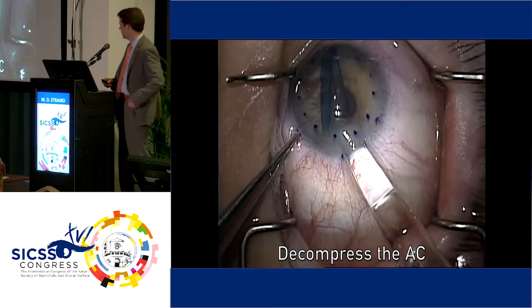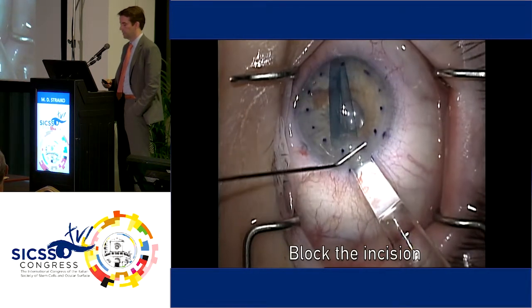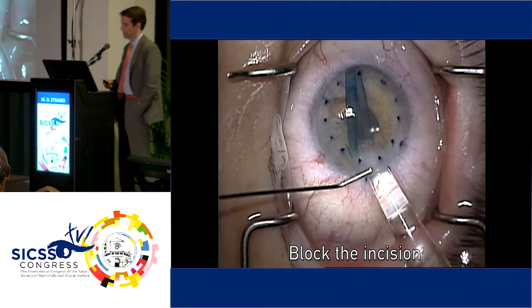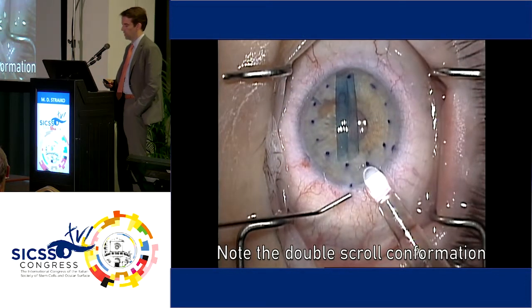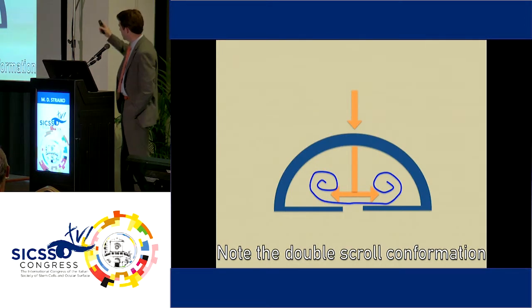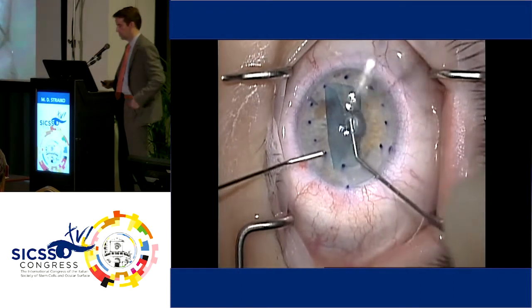I'm decompressing the anterior chamber with some forceps there to make sure I don't overinflate the anterior chamber. Then I'm blocking the incision with a cannula. And I can see that the graft is in a nice double scroll conformation. So the tapping, you tap on the cornea parallel to the graft. It generates a fluid wave that goes down along the iris plane and helps knock those scrolls open.